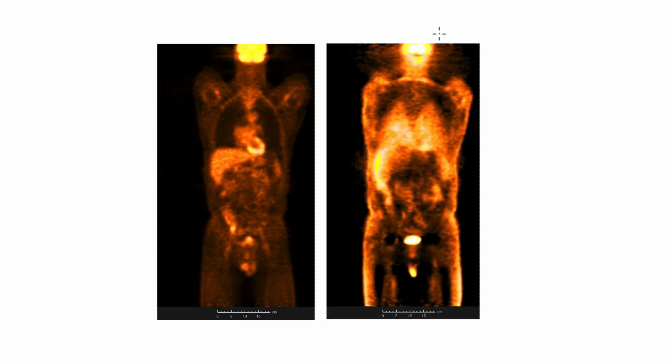Here's another view of the same patient at coronal cut, and you'll see again the uptake of the FDG in the brain, the heart, the liver, bladder. The tumor is in another cut here that you can't see. Now on the right here, I'm showing what the image looks like if you don't have attenuation correction.